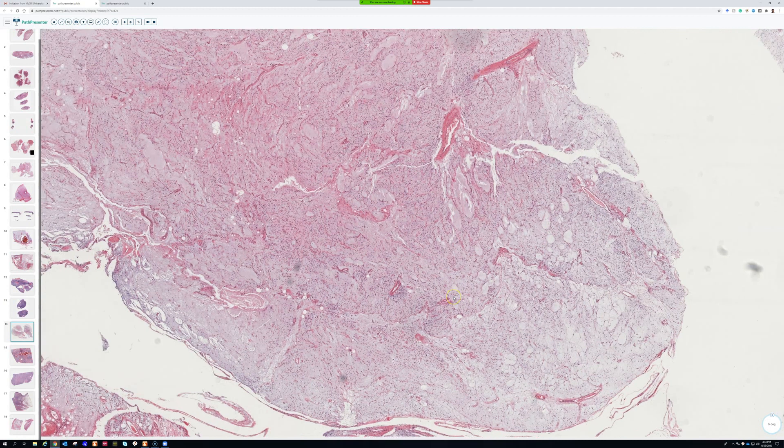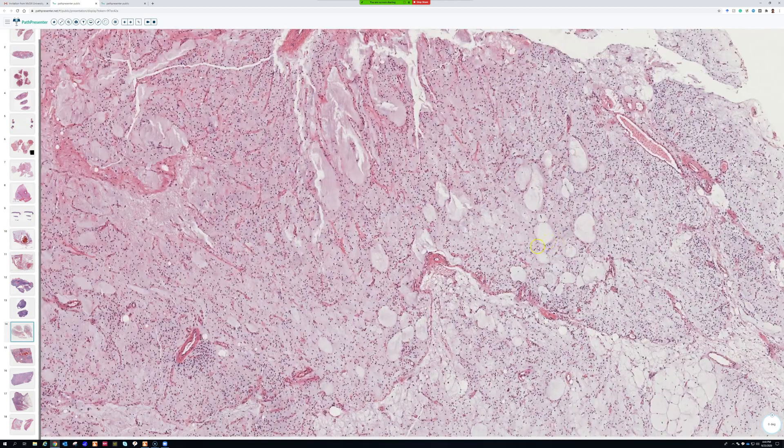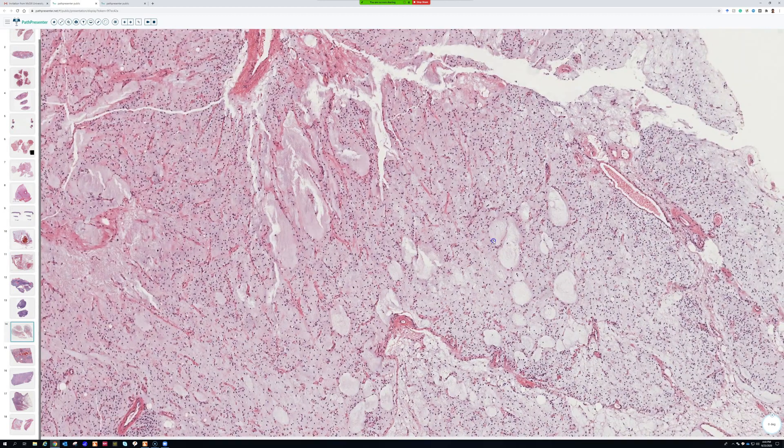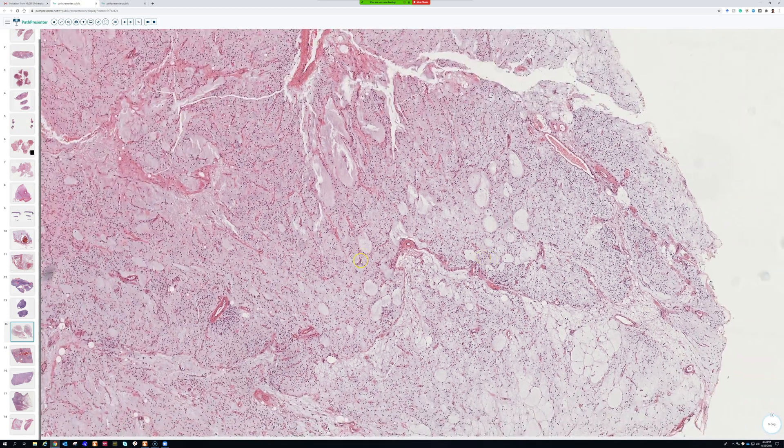Slam dunk — this is classic myxoid liposarcoma. I just made a really long video about pretty much everything you could want to know about the basics of liposarcomas, and you can refer to that if you want an in-depth discussion. A few things that help: they are hypocellular with a myxoid background.